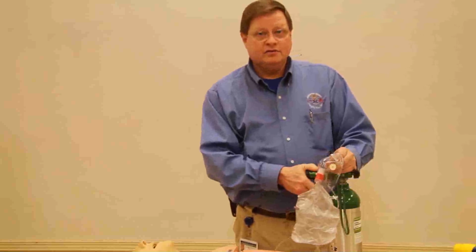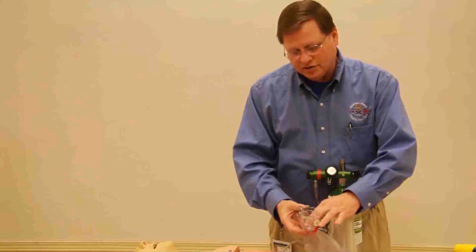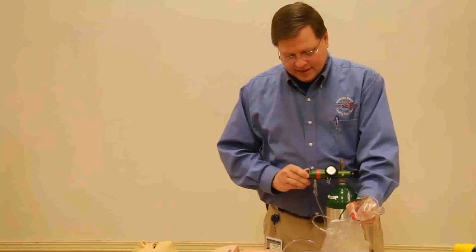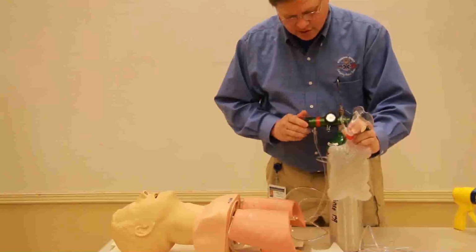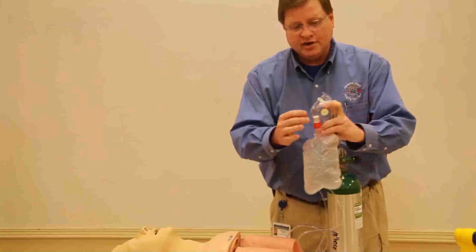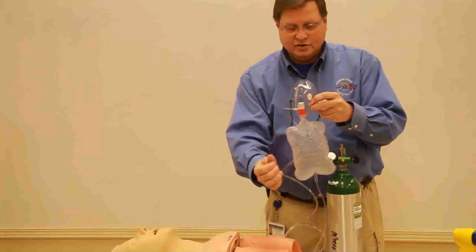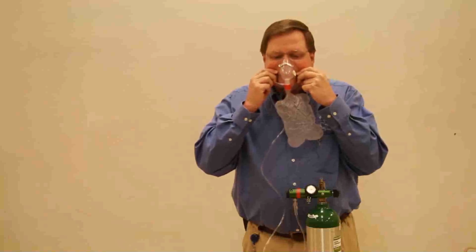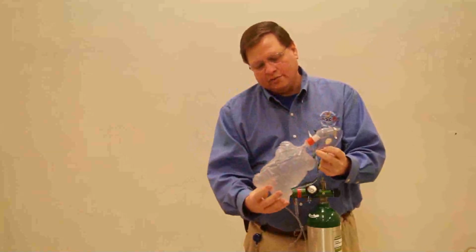So now what we're going to do is we're going to hook the mask up. Again, before we ever go to the patient with it, we're going to hook the mask up, and now we're going to open our oxygen tank. And when we do, I want to make sure that I have my oxygen reservoir closed off with my fingers, and I am going to make sure that the reservoir stays full. Now, as long as the reservoir is full, then you're okay. I'm going to demonstrate breathing through this so that you can see that the reservoir will stay full, and this is at about 15 liters a minute. So you can see the reservoir will stay full.